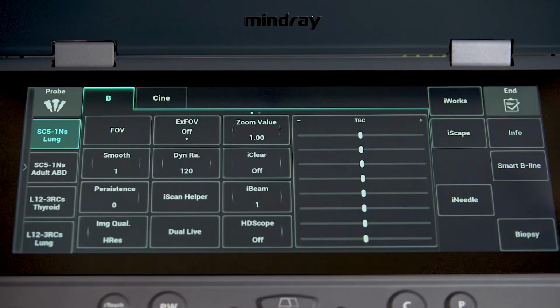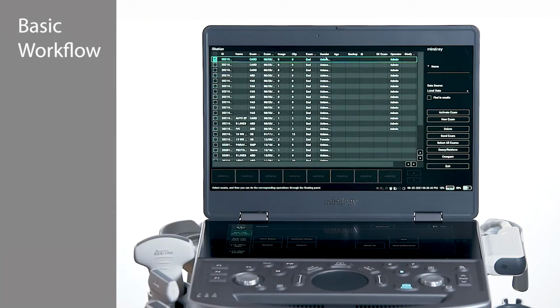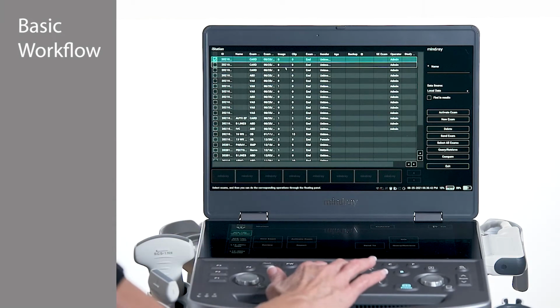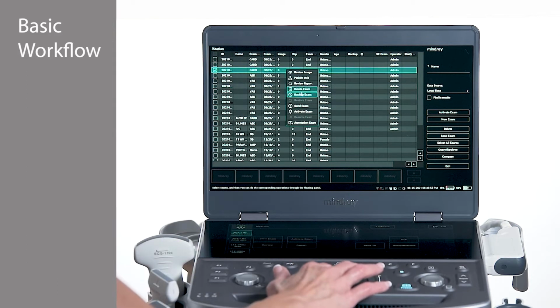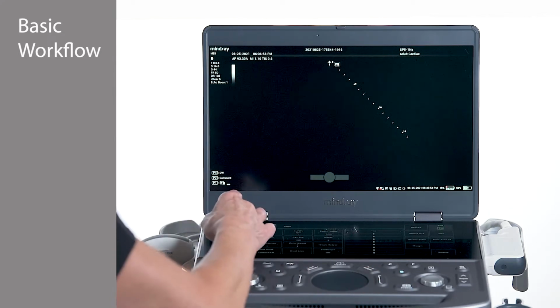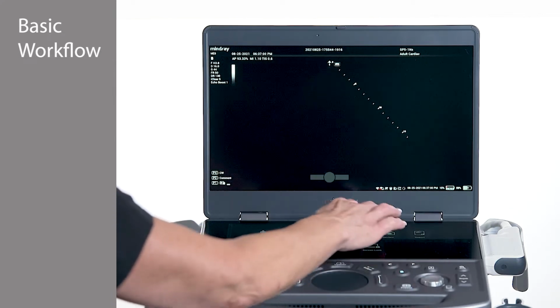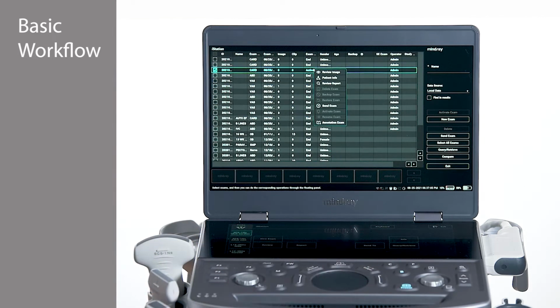The iStation tab activates the patient archive or hard drive. Review, delete, or send past exams from this page. Prior exams may be reactivated for up to 24 hours in order to add or change data. To do this, highlight the desired exam, then tap Activate Exam in the drop-down menu. Other available options will be illuminated, including to manually send an exam to PACS or other storage media.